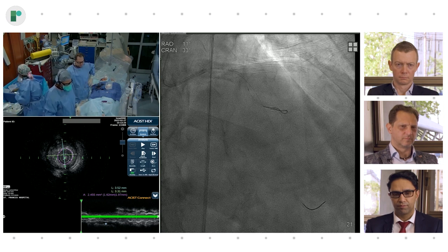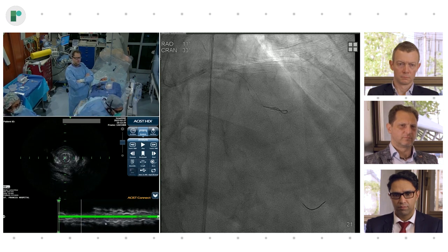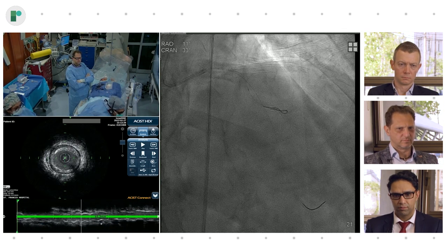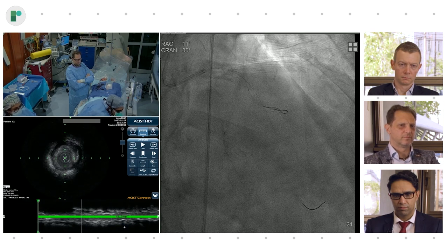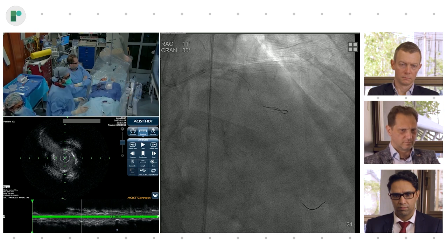New one. And what I'm going to do is, thanks. So what we're going to do in the meantime is just go across and look to see where the artery actually gets to 3.5. So you can see that really quickly after this branch. You see this branch? And that is typical for us.